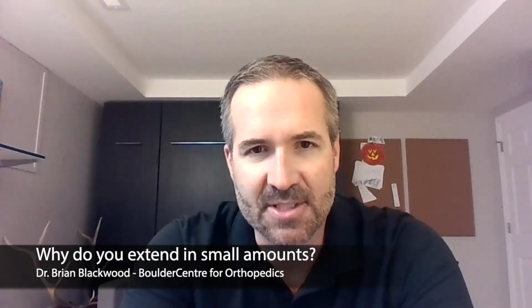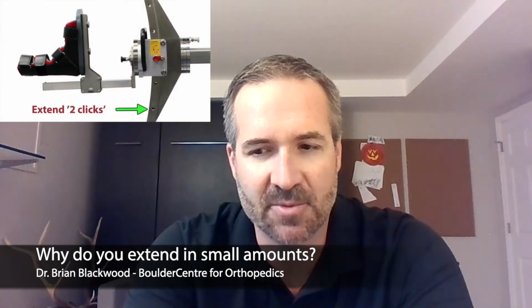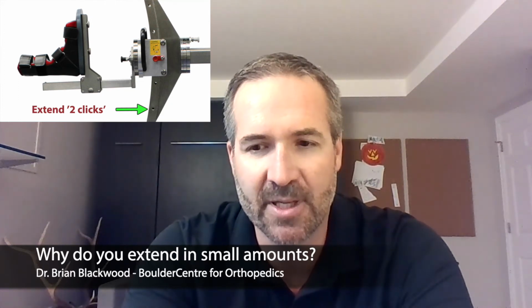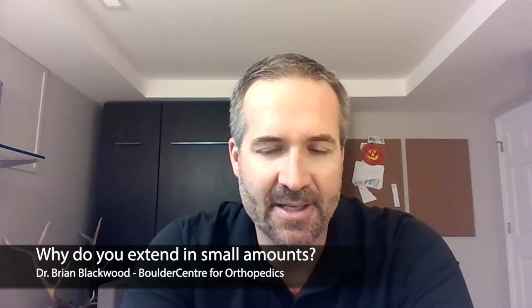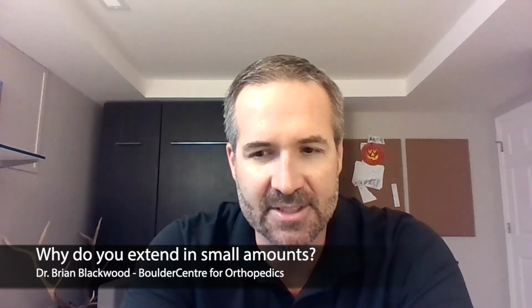It really allows you to see which tissue you want to use, especially that initial 2-click drop sort of puts the abductors posterior a little bit, brings the proximal femur forward. And so you can really identify the difference between the capsule and the abductors and know which tissue you're releasing. And so you can be safe and confident that you're releasing the capsule and not the abductors.